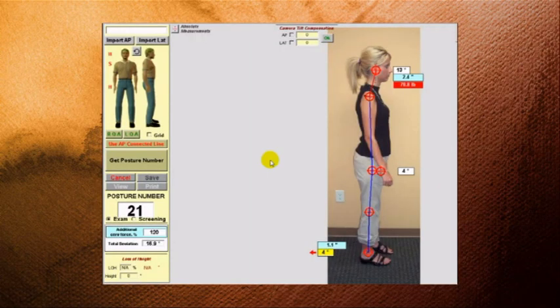The next thing you'll notice are the crosshairs that have been left on the picture. You'll notice how easy it is to see where the offsets are based on these new crosshairs. And the lines are connected right to the center dot of the crosshair. And as you explain to the patient that all of these crosshairs should be on top of each other in a straight line, it's easy for the patient to understand where the offsets are and how much they are. These marks will also appear on the printed reports.